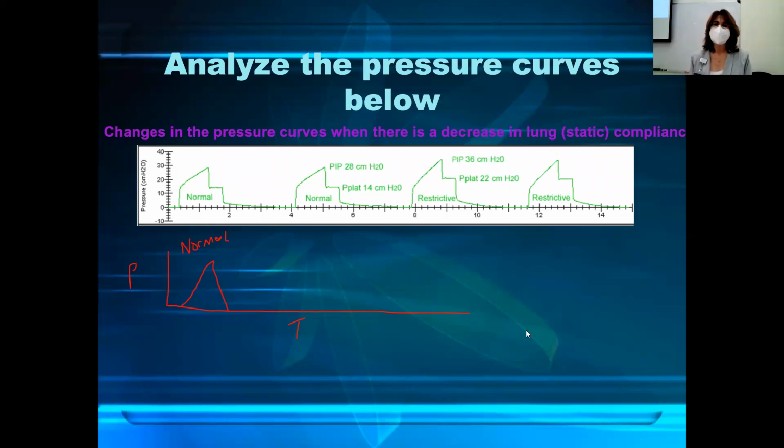Summer thinks maybe you're thinking of capnography, the capnograph. Yes, good going, Summer. Thanks, Summer. Yeah, so you're looking at the amount of carbon dioxide coming out of the lungs. Correct. Now we know.